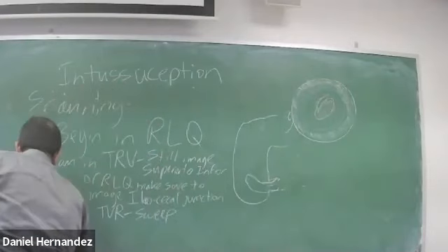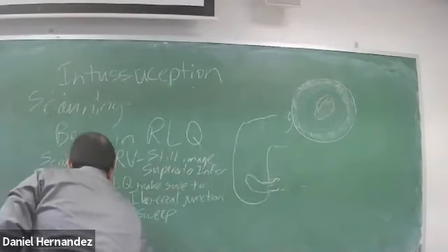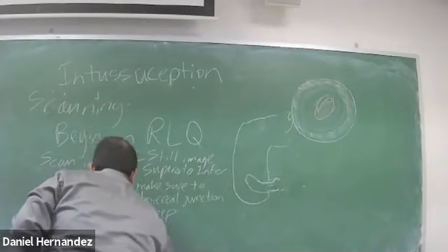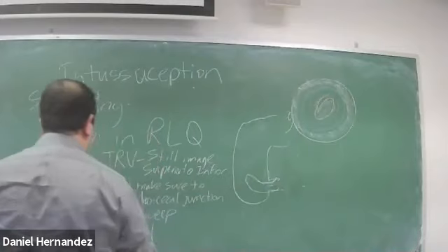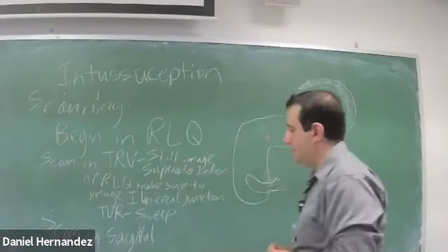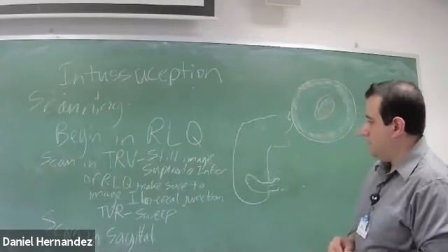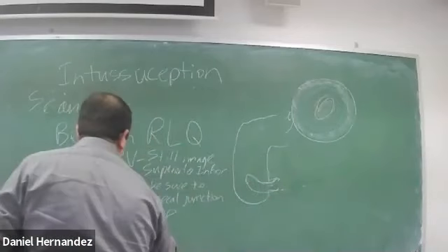Then I'll scan sagittal. So I'll kind of reverse the process now in sagittal.